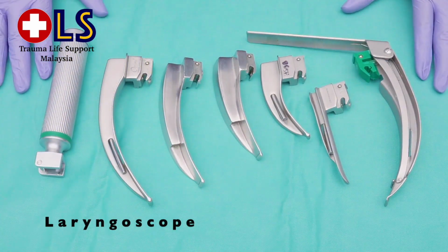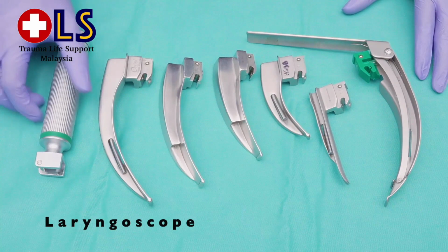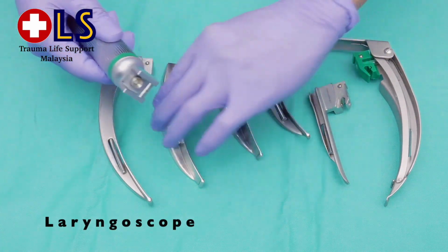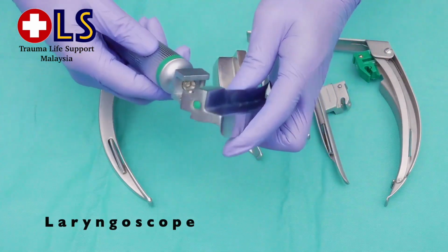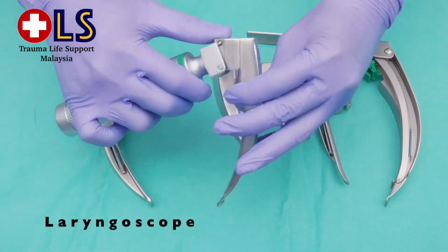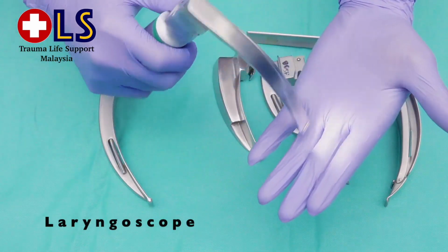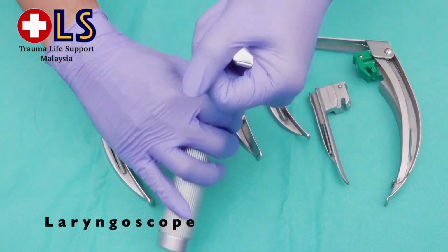Ensure that the bulb is functioning. By holding the handle, connect the blade and the handle via the hook of the blade. Open it up and check the bulb like this.